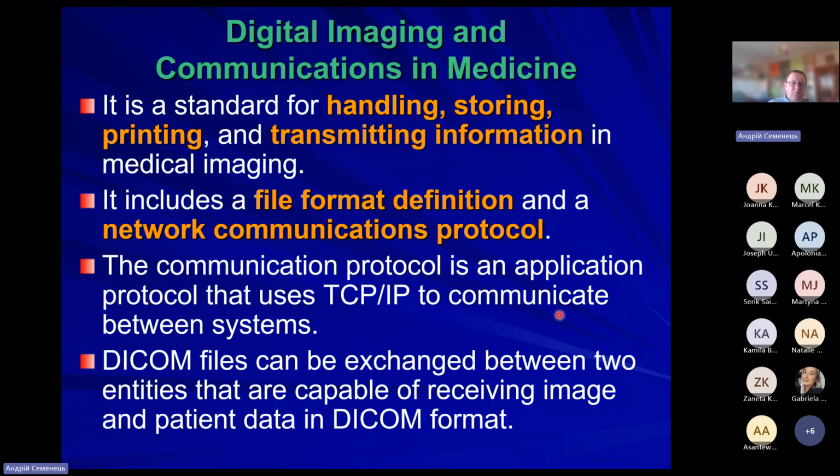Moreover, all modern diagnostic equipment has features to directly communicate with the hospital information system through a computer network, wired or wireless. That's nothing unique right now.